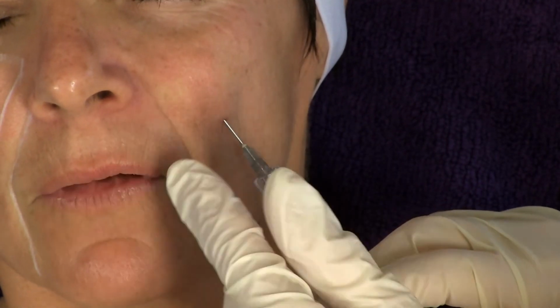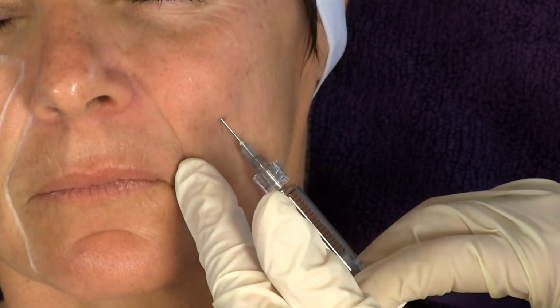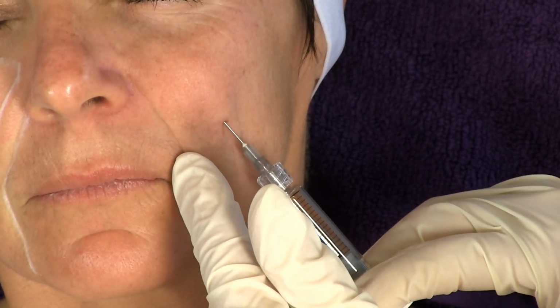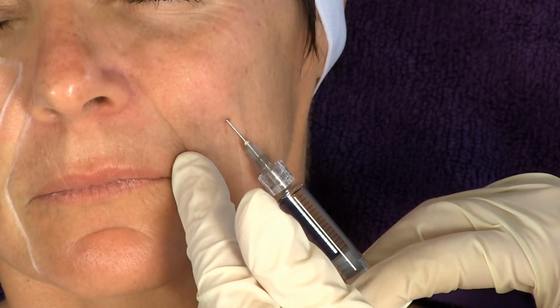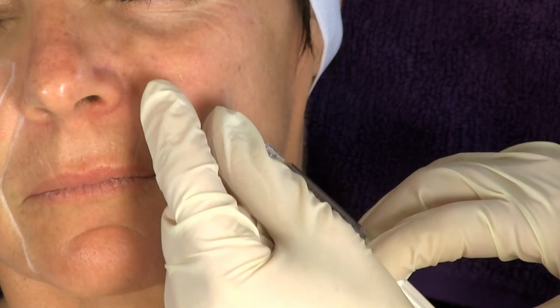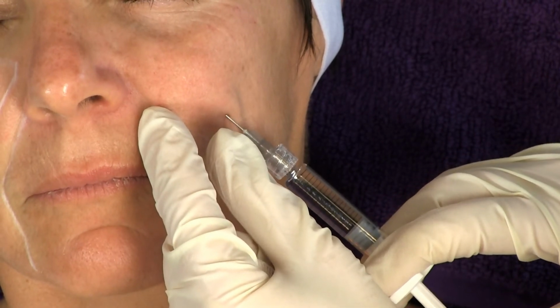Inject multiple strands of filler using the fanning technique in a retrograde manner. Maintain depth to inject at the supraperiosteal level.